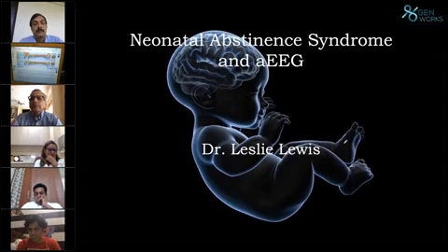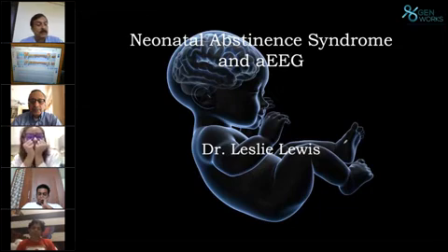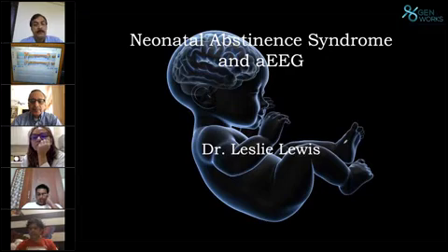Once it loses, what happens? Tissue hypoxia will start. Because of that, primary energy failure will start. That is the reason low voltage will come. The similar thing will happen even in hypocarbia. Hyperoxia, hypoxia, then hypocarbia, then hypercarbia, the same thing will happen. Some people might have asked the question, and you have explained in detail, that there is a limitation if it is a deep-seated small pathology or low electrical activity, sometimes we might not be able to pick it up. So that is one. Thank you very much, sir.